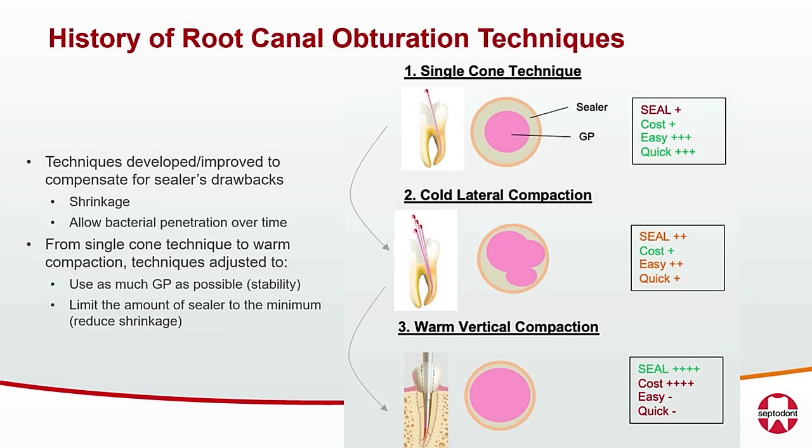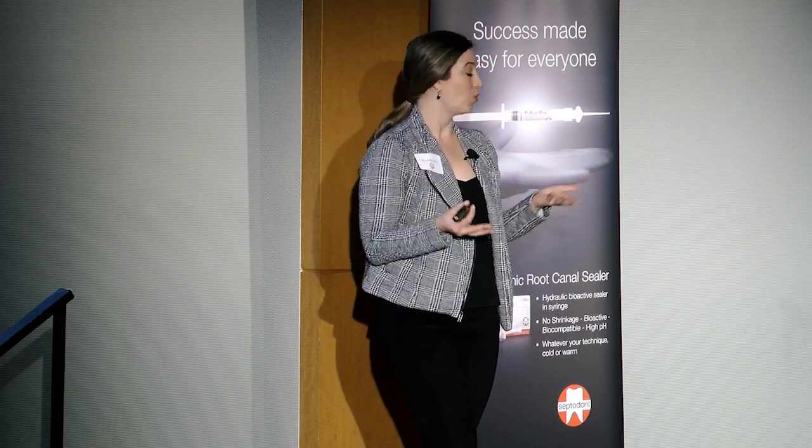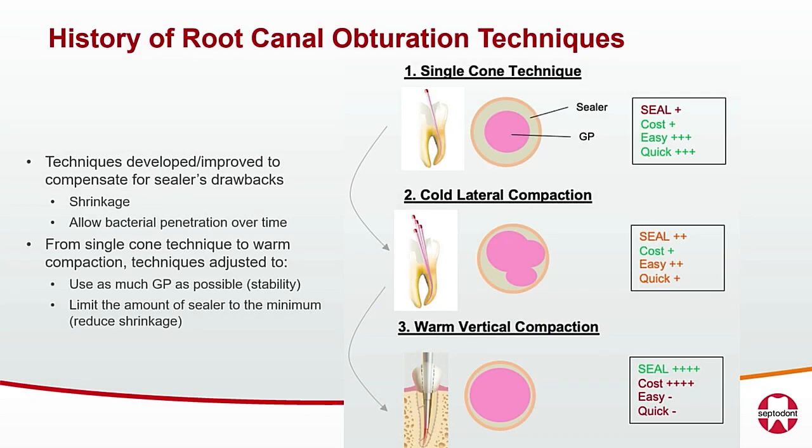Many of us learned cold lateral compaction as the way to obturate. The idea was that you want to maximize the amount of gutta percha in the canals because the sealer could not be relied upon. Sealer shrinks. Sealer ends up washing out. The sealer is not antimicrobial. The idea was we needed to entomb bacteria, and the best way to do that with older sealers was to maximize the amount of gutta percha in the canals. So cold lateral compaction became quite popular.